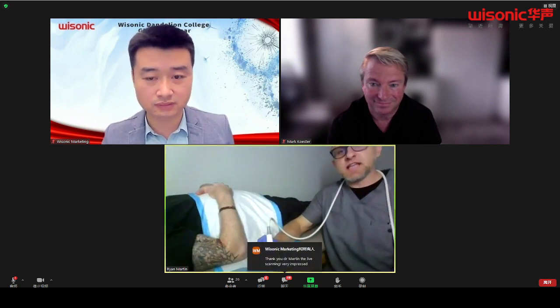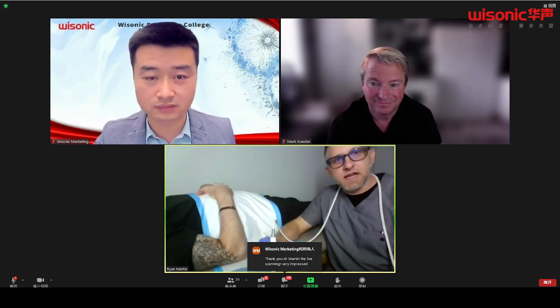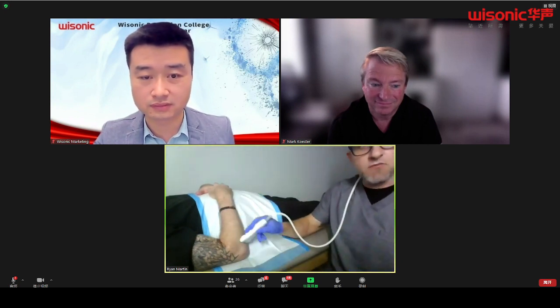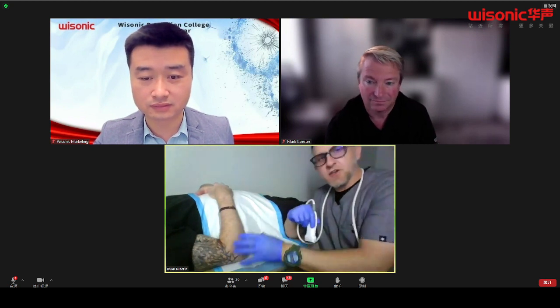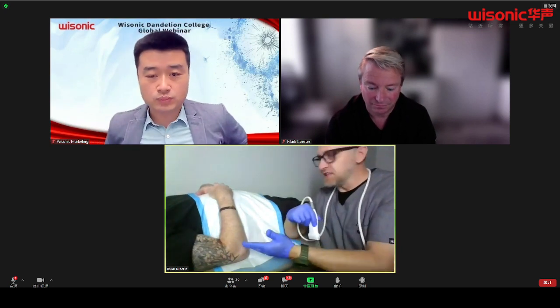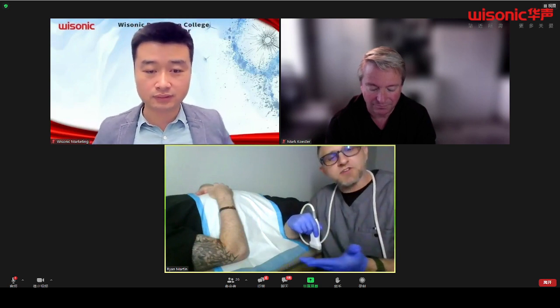what we're going to do is now we're going to go into the lateral component, or the common extensor, and the lateral collateral, or the radial collateral ligament. Now, again, all these are happening right in the same area. So it makes you wonder, if there's pathology there, this is how you can differentiate it. One, your special testing, your history, they often make sense. And then finally, your imaging should help confirm or deny what your original suspicions were. So since we're already here, let's go ahead and start looking at that lateral collateral and the common extensor tendon.